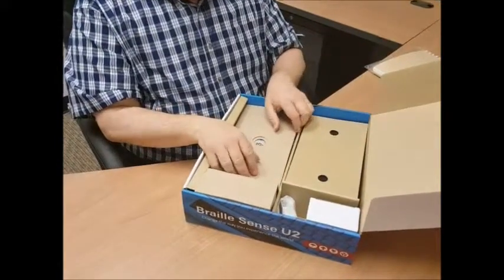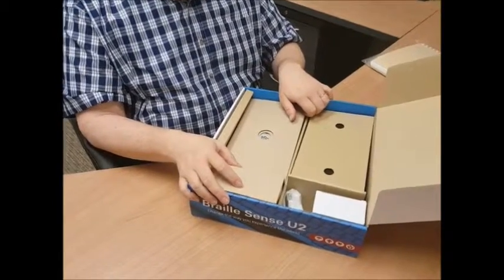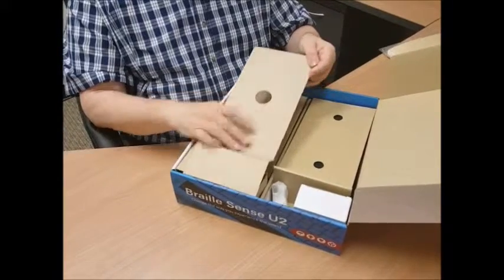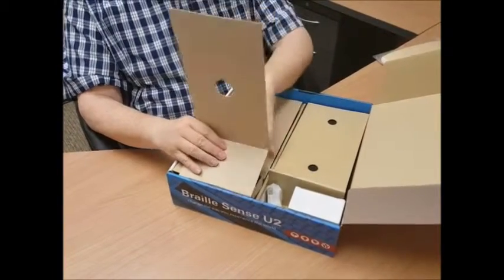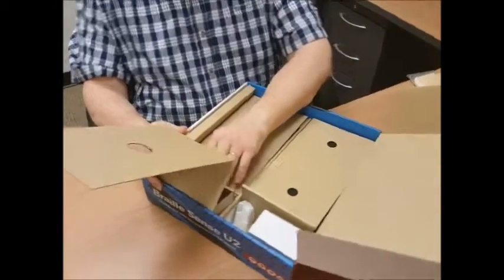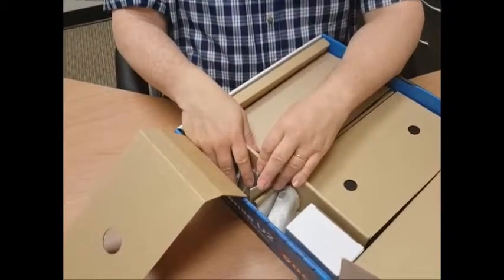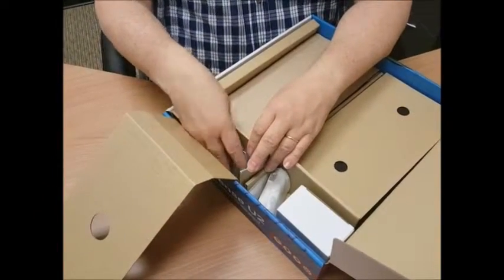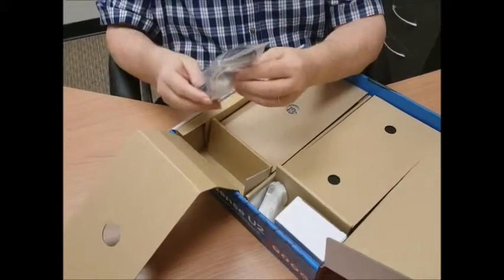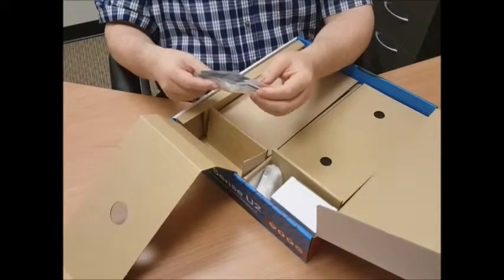Now we're getting close to getting to the U2. On the front left side, I open up the first part of the cardboard flaps. In that compartment that was covered over in the right front corner is another bag that contains your USB cable and your earbuds. So that's where they're hiding.